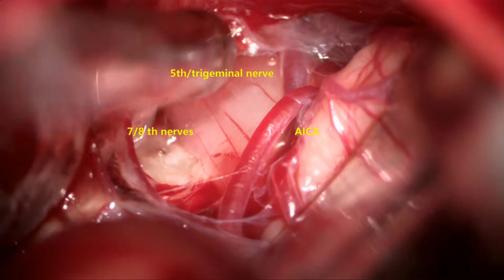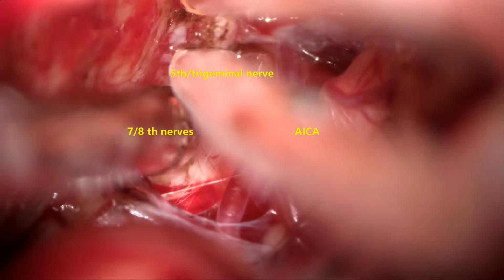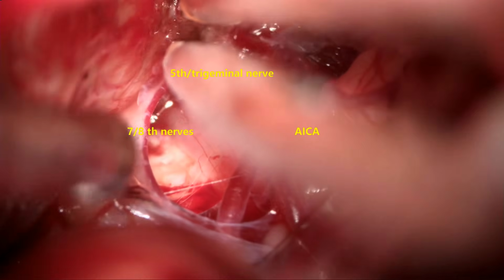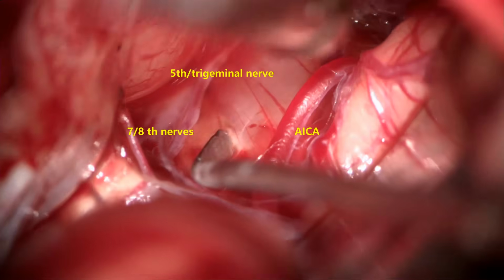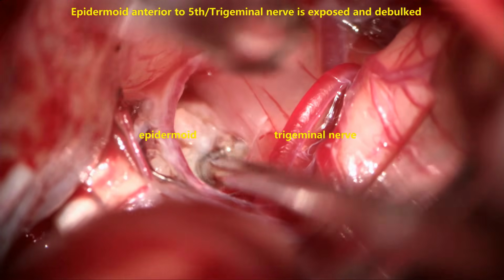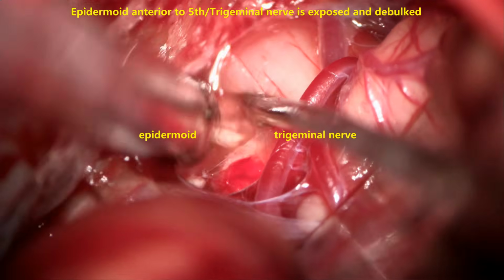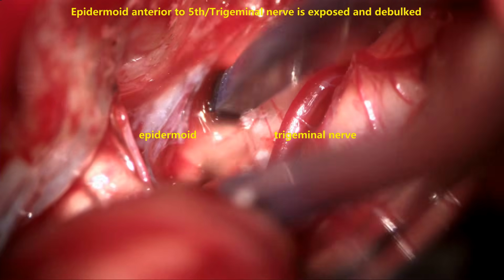Now you can see once the arachnoid is open, there is the blood supply coming from the posterior temporal region, which is coagulated, and directly the trigeminal nerve is seen there, elevated towards us, that is posteriorly, and anterior to that there is an epidermoid.